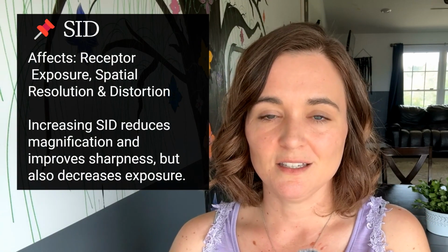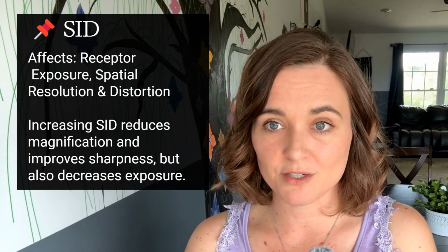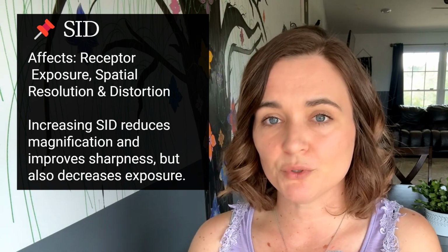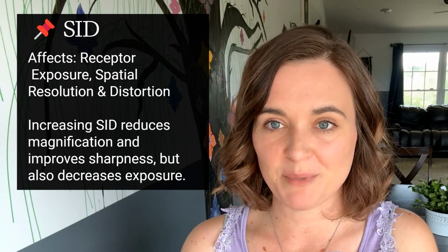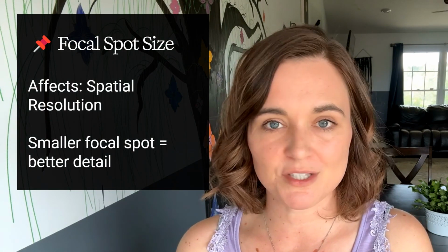Your SID, this is your source to image distance. It affects all three pillars. Increasing SID reduces magnification and improves sharpness, but also decreases exposure. Here's a pop quiz cue. Which factor affects all three pillars? SID. Focal spot size affects spatial resolution.